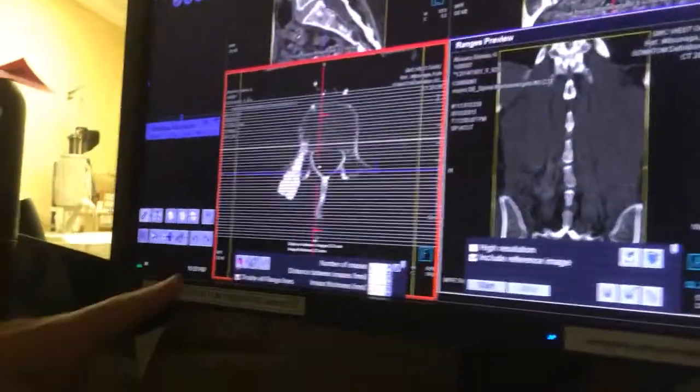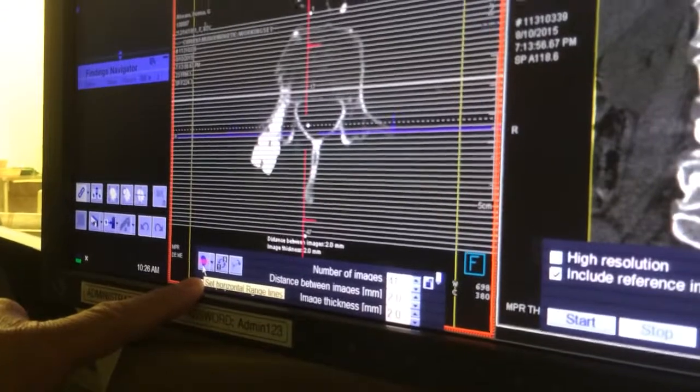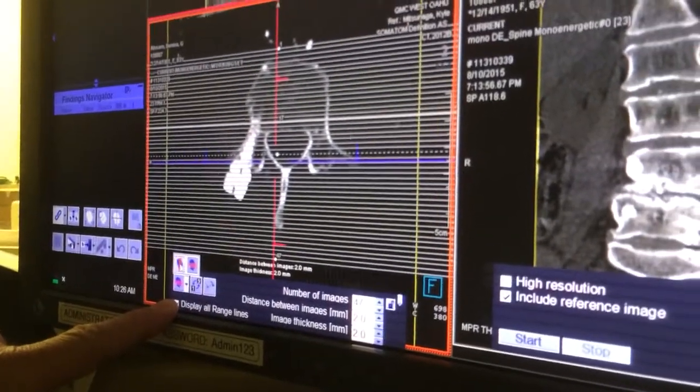Now you want to do a sagittal. You just flip this up right here.